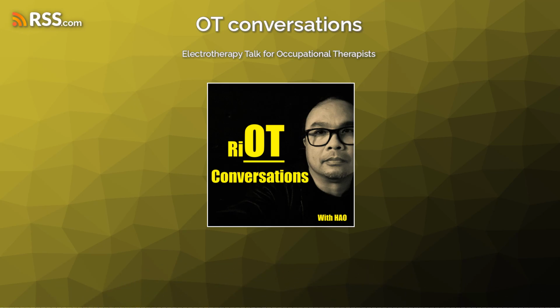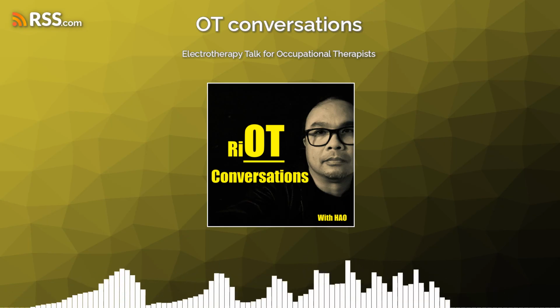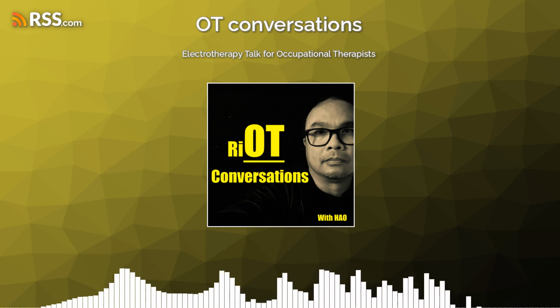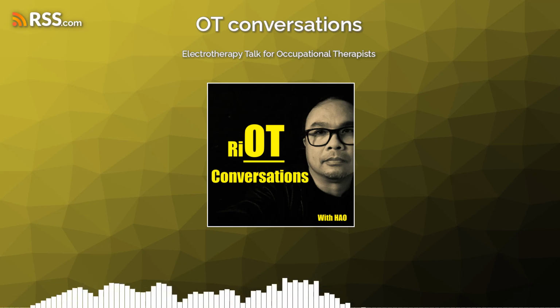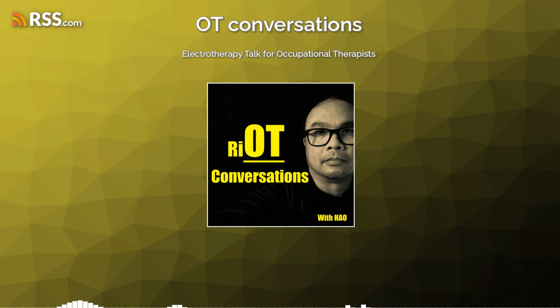Now let's talk about the precautions and some of the contraindications. Right. Precautions and contraindications. One, you should avoid it in certain conditions, and it's not recommended for individuals with pacemakers or implanted defibrillators or for those who have active infection.